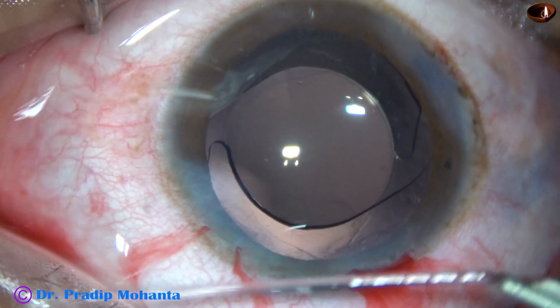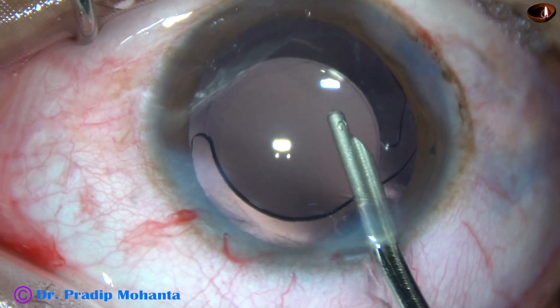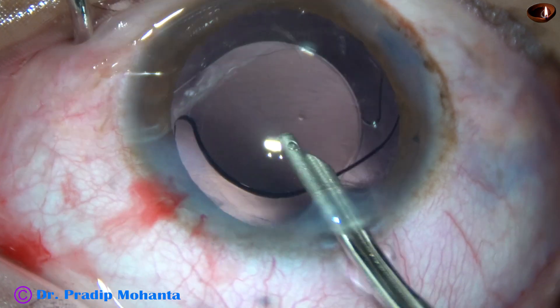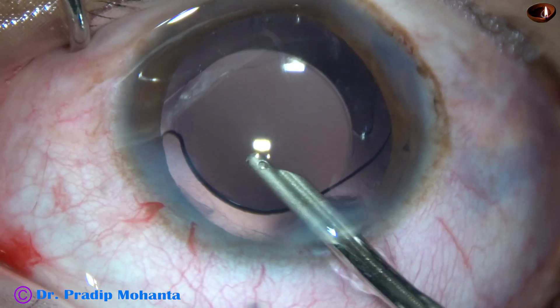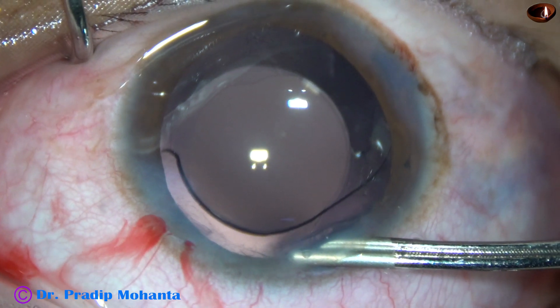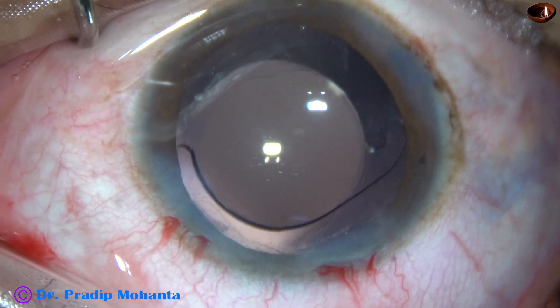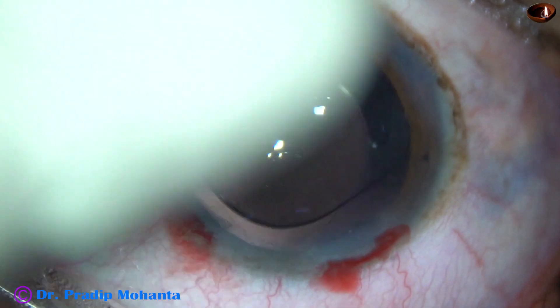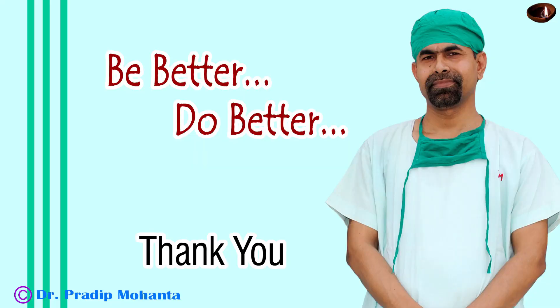And now the side ports are closed by hydrating the corneal stroma on either side of the stab incisions. And then this is the final lavage of the anterior chamber with pure BSS. The anterior chamber is nicely formed so that the intraocular pressure is on the higher side of normal. The integrity of all the wounds is checked with a cotton-tipped applicator. A few drops of Moxifloxacin are applied over the corneal surface and the case is concluded. Thank you very much for your attention. Always remember that complications can occur at any moment — we must take extreme care from that moment so that we can complete the case beautifully and the patient gets as good vision as if the complication would not have occurred.